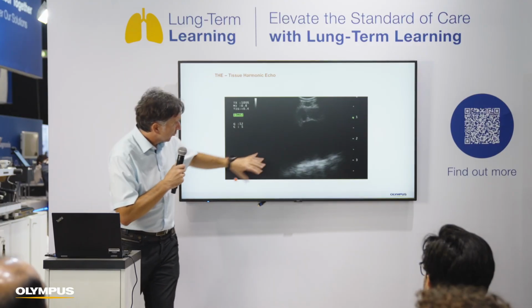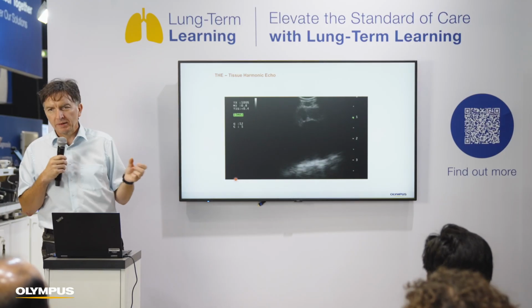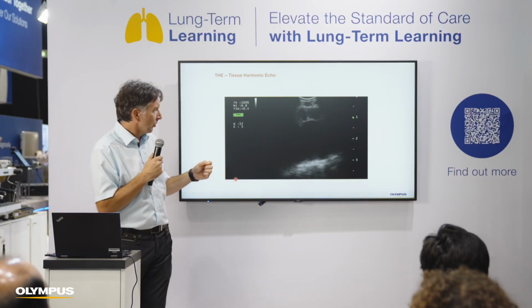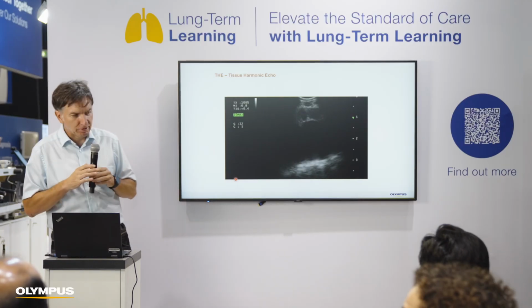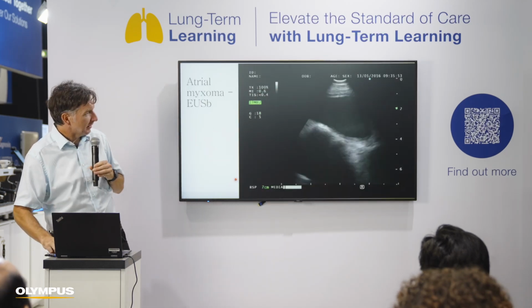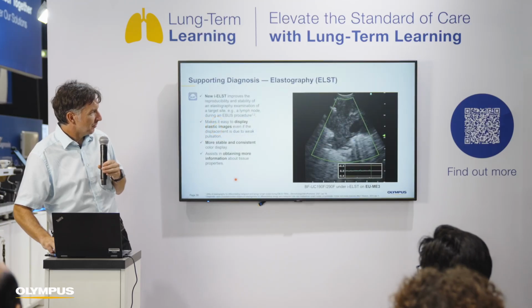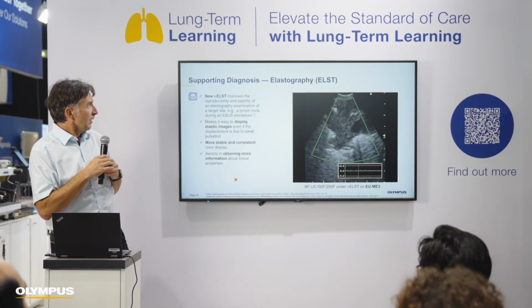I hope that the video starts. It should show a slight difference when we change the normal B mode to the tissue harmonic echo mode, and the center of the image is slightly more resolved and sharp than in the classical presentation. But I'm sorry, I think that these movies were not copied properly.